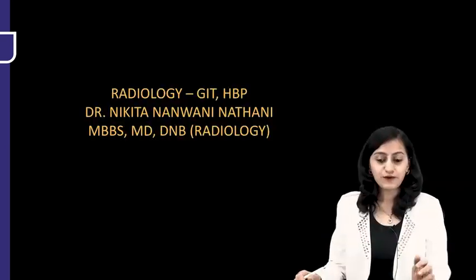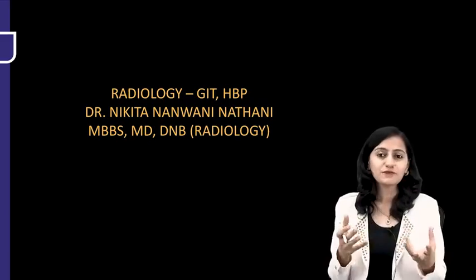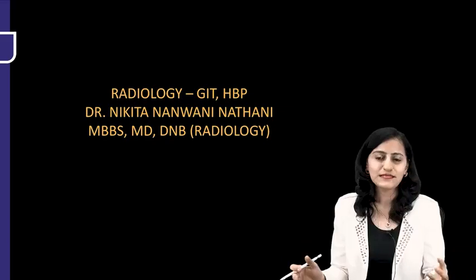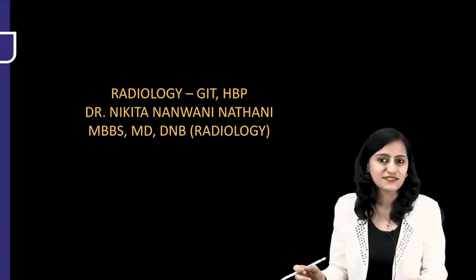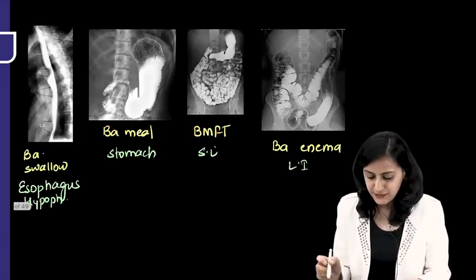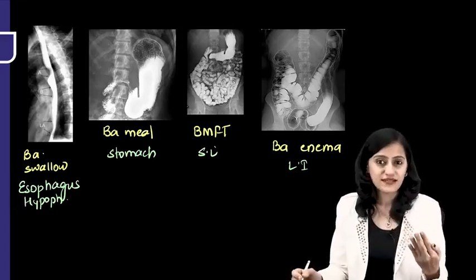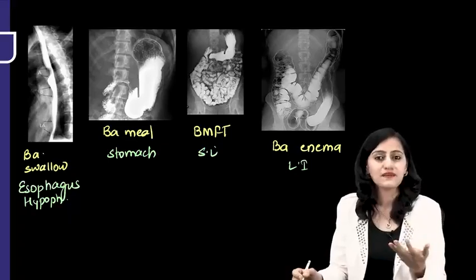Okay. So now we are going to learn about GIT and hepatobiliary and pancreatic radiology, focusing on the must-know and frequently asked images. All of these are must-know for the exam. So first, let's quickly identify the investigations here. The GI contrast studies are done by giving barium.